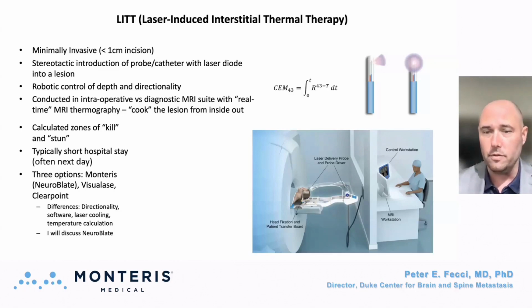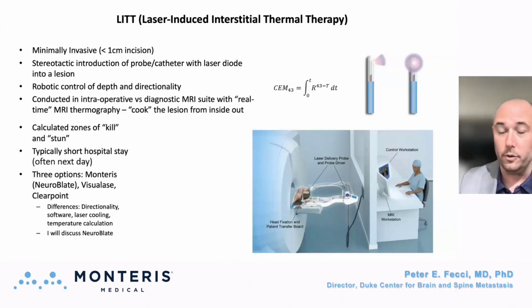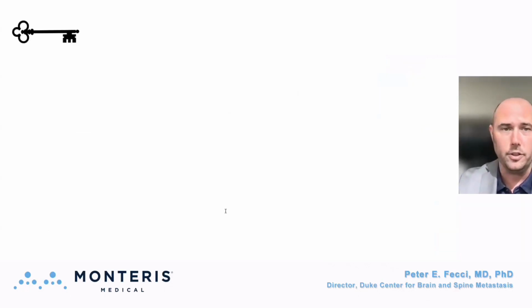and its interpretation of thermography, type of laser that's being used, as well as the cooling of that laser, and how the software calculates temperature. For full disclosure, I'll be just discussing the NeuroBlate system. So some key points off the bat.